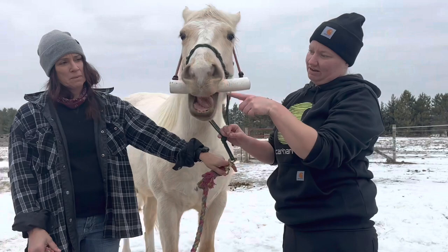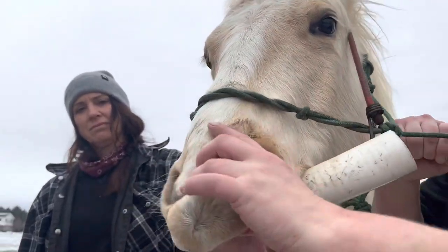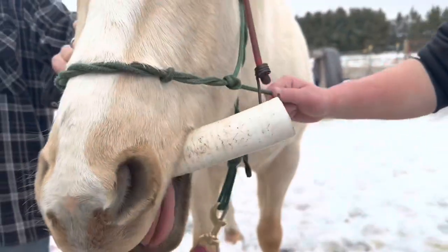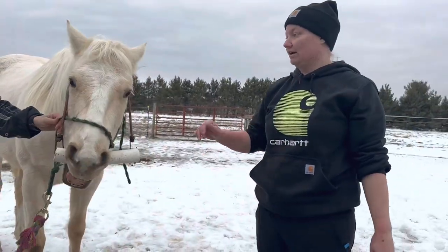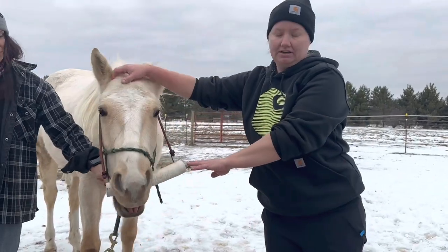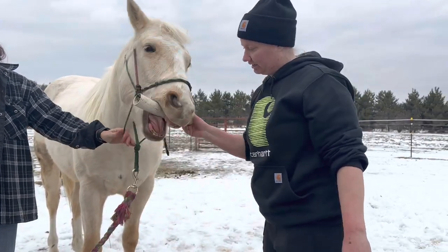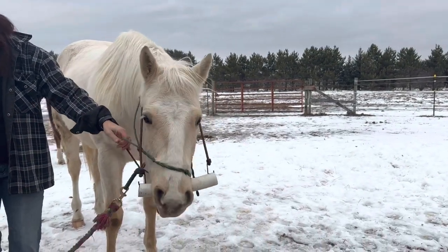And you can see, if you want to get close, that tooth right there. See how loose it is? We're just gonna pull that cap off. That way he won't accidentally swallow it, which they do swallow them. It's normally not a big deal at all. But sometimes if they do swallow them, it can get lodged somewhere, and that'll cause an abscess and stuff like that if left unchecked. So we'll just pull it off that way. You don't have to worry about that.